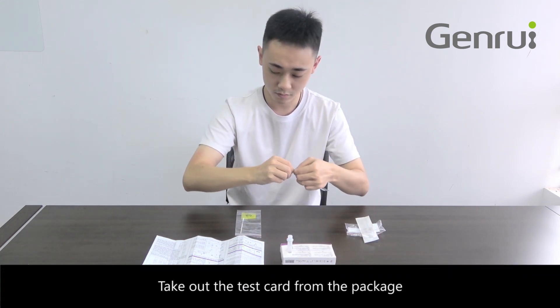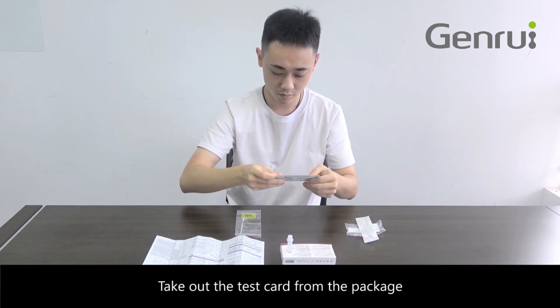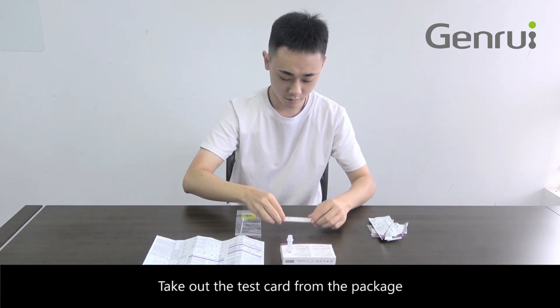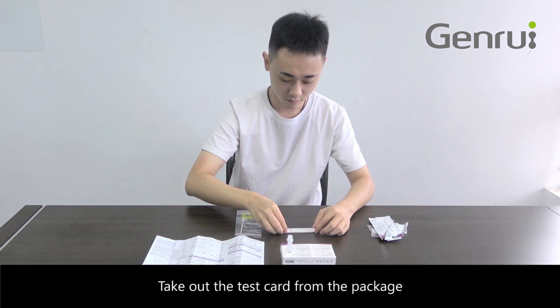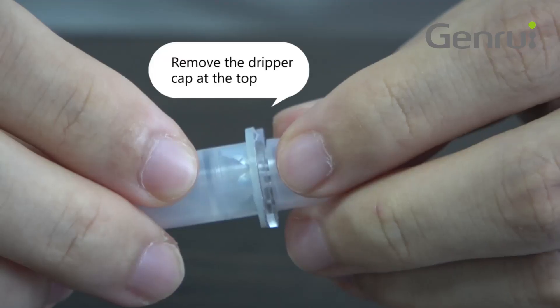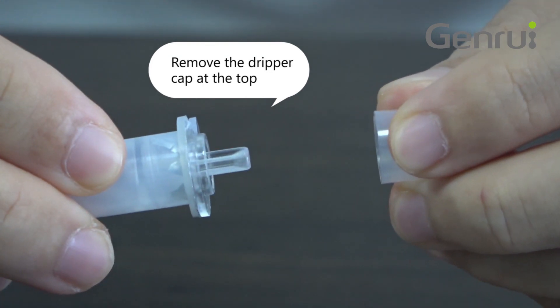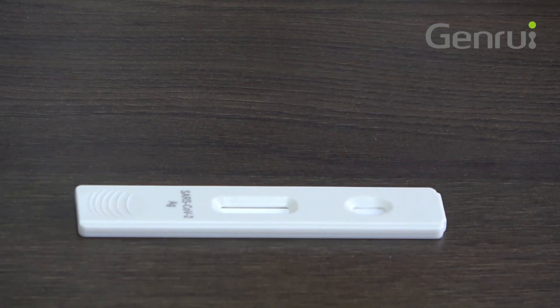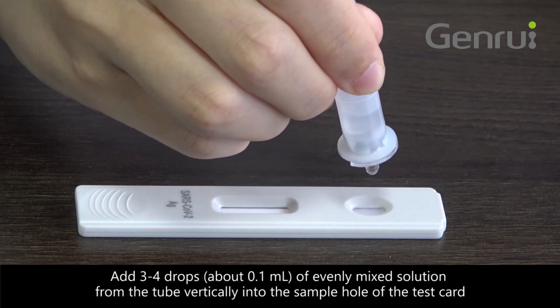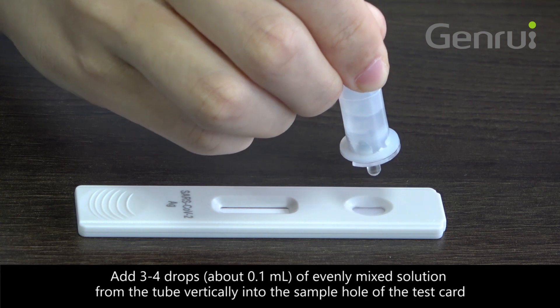Take out the test card from the package. Remove the dripper cap at the top. Add 3 to 4 drops, about 0.1 ml, of evenly mixed solution from the tube vertically into the sample hole of the test card.